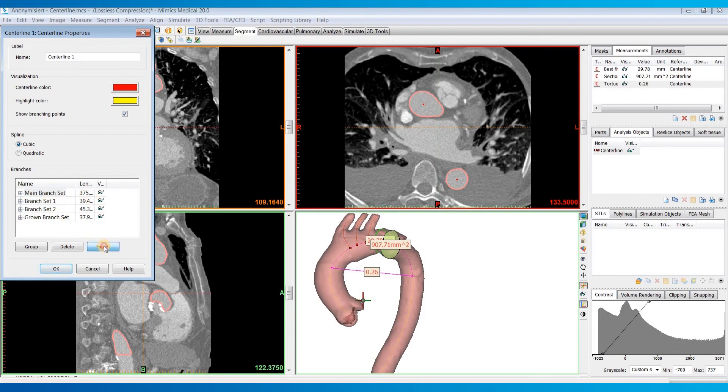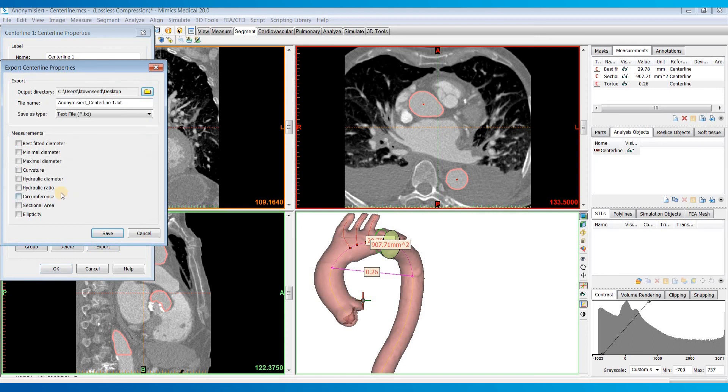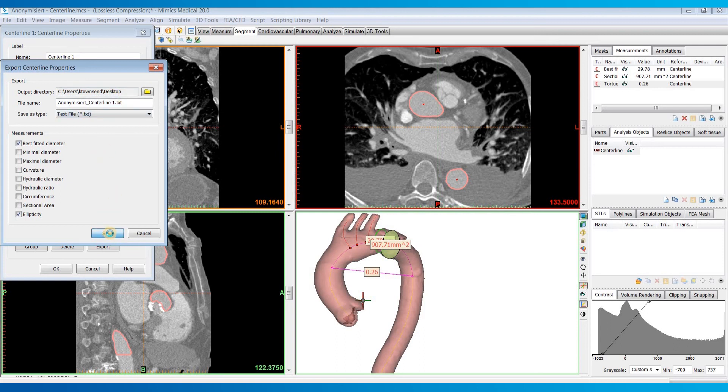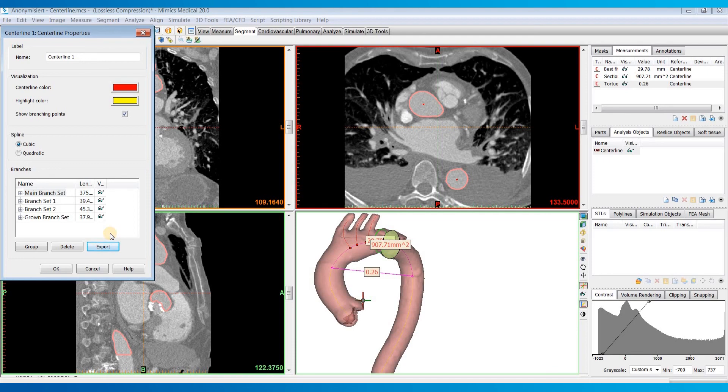So let's just maybe choose the main branch one. And then we can click on export. Choose which measurement we're interested in. I'll just do maybe ellipticity and best fit diameter. Choose your output directory, file name, and hit save. And this will export out a text file that will contain those measurements at each of the control points in that branch.